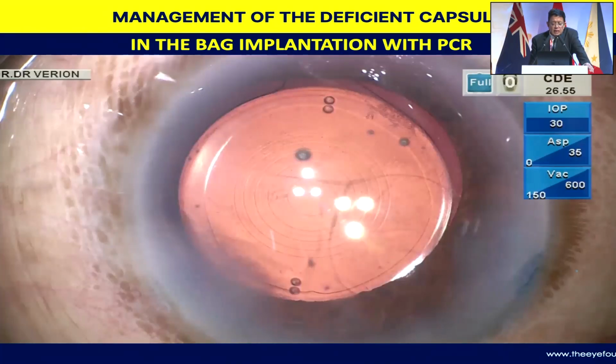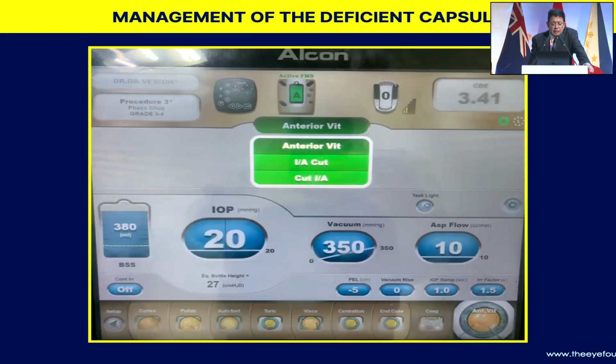So just in case you have an adequate amount of PC support, in spite of the PC rent being there, it's possible to go ahead and implant the intraocular lens in the bag with no compromise in the results. This is a basic concept all of us have to understand, in the sense that when you are doing an anterior vitrectomy, go ahead and have this cut IA mode on, where you cut the vitreous strands and subsequently aspirate.